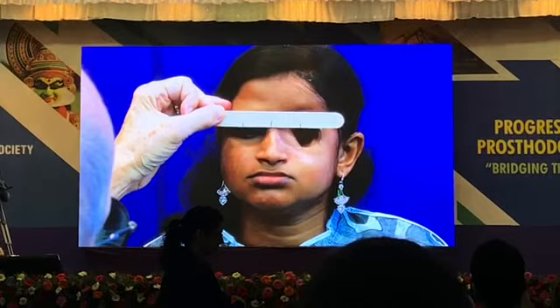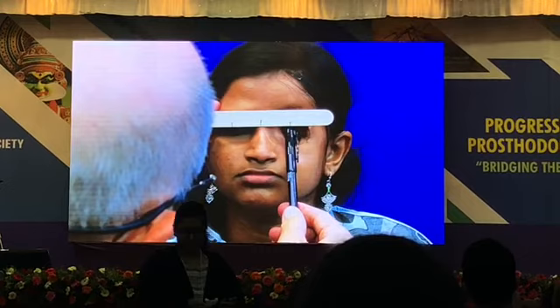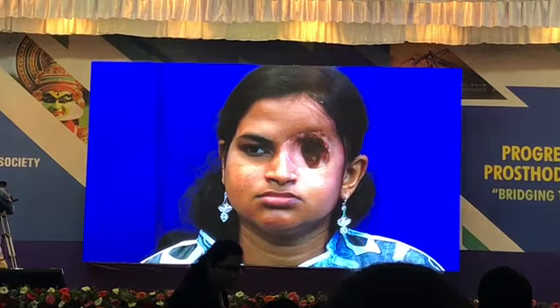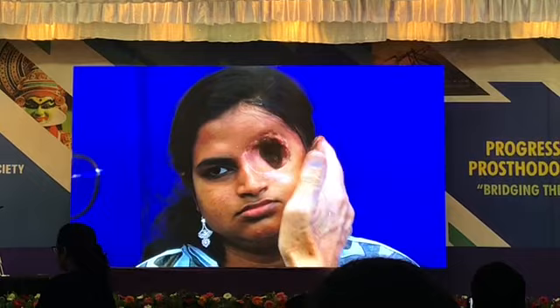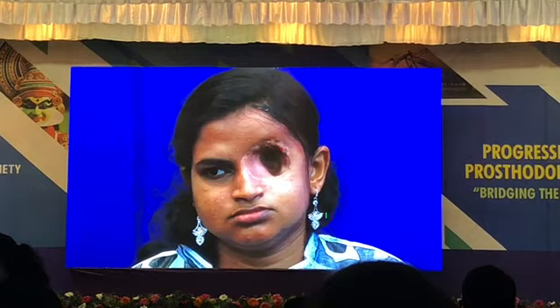See that? So now you want to put the globe where the pupil is, comparable to that mark. And first, what did I say? You need to generally move the eye a little bit medial to make it look normal, because her side of her face here, you can see the contour is not as prominent on this side as it is on this side. So if you put the globe in the same position, it'll look like it's too far out to the side.